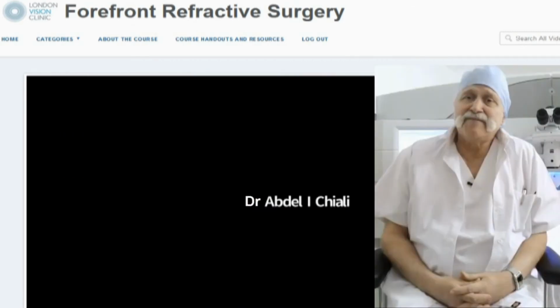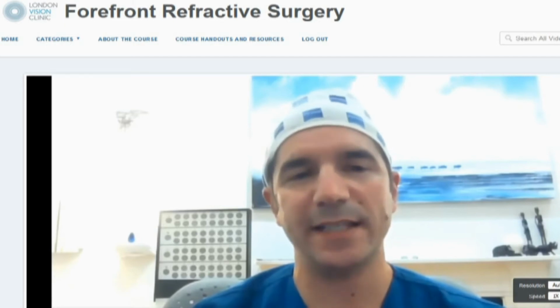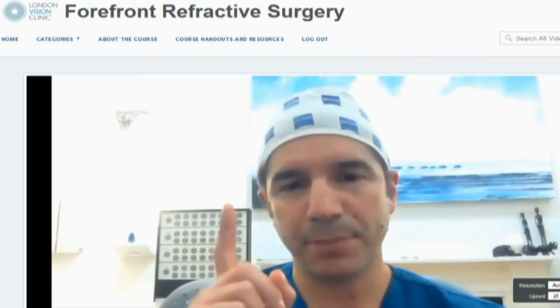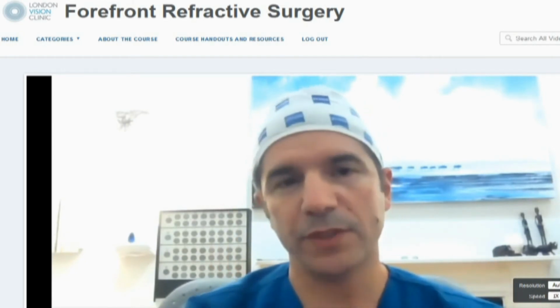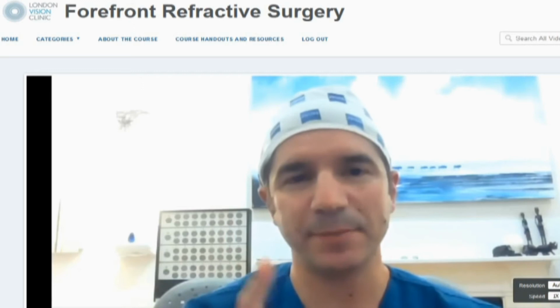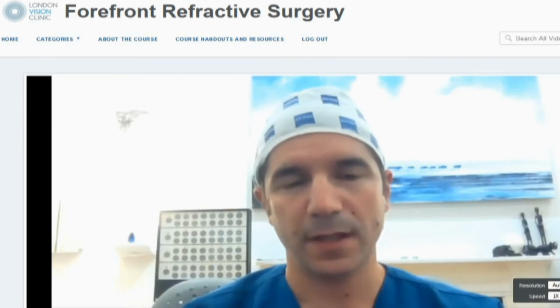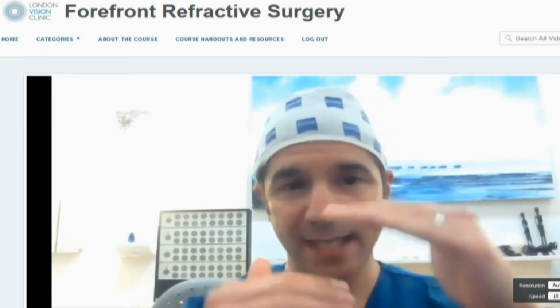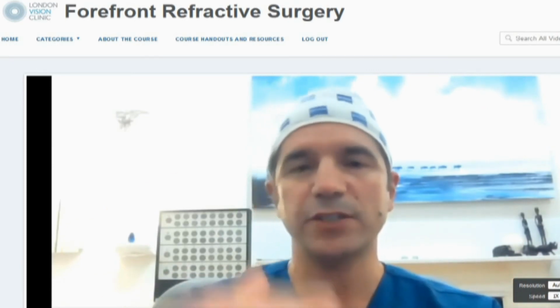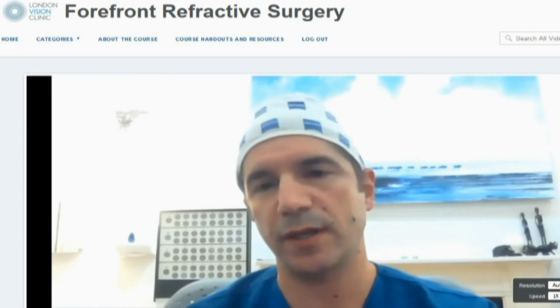Sure. But it does bring up an interesting point, and we'll talk about this a lot next week. If you ever create a lenticule interface, a bubble pattern in the lenticule cut, and that bubble pattern is not smooth, or it's not complete, you should never attempt to repeat a lenticule cut at the same depth again, expecting the bubbles all to match up exactly the same. Because there is a chance that you can be slightly off and you end up with slivers in what is, again, a refractive cut. There are ways around this. You can change the depth of the cap and things like that. And this is something that Dan's going to talk about during the suction loss talk next week as well.